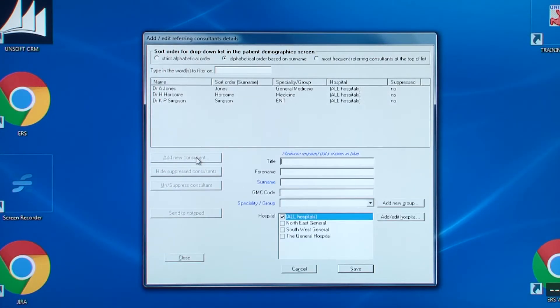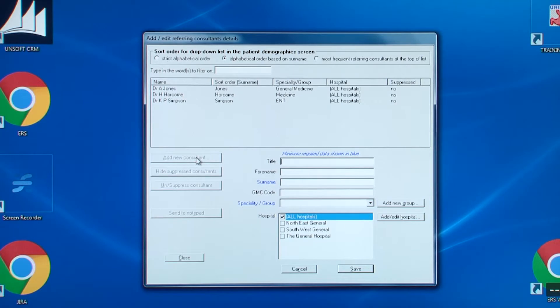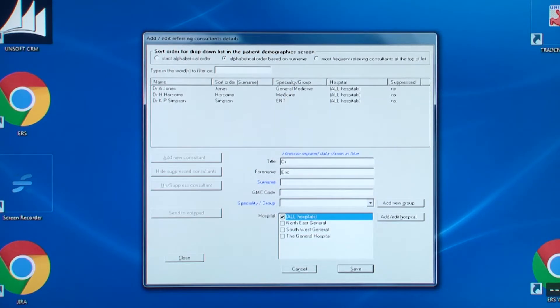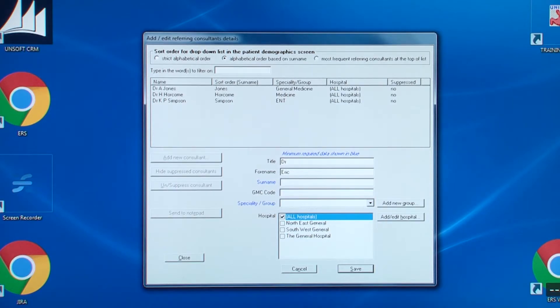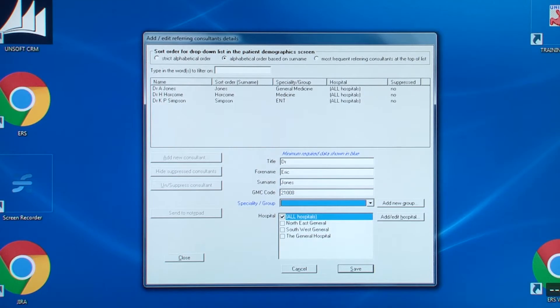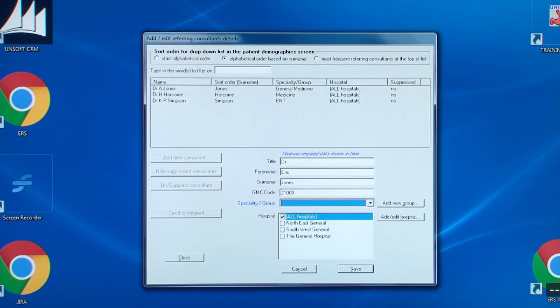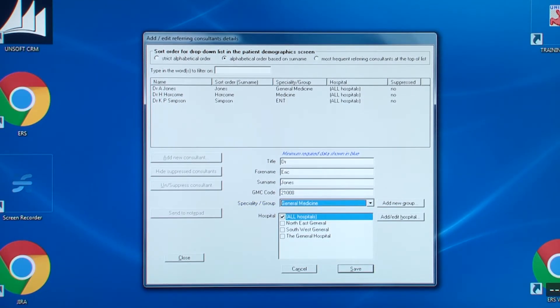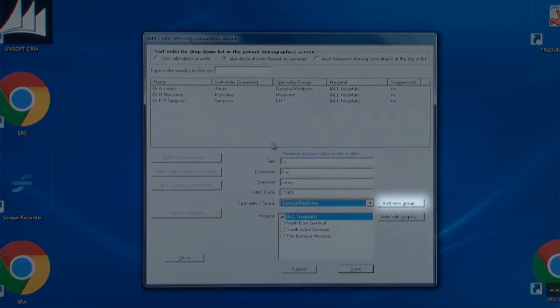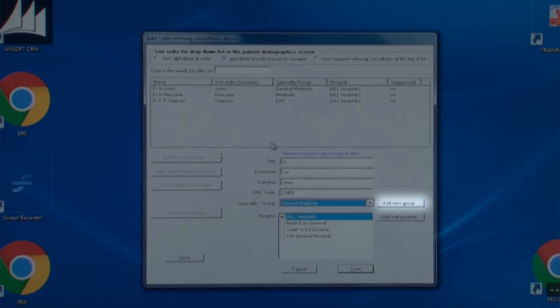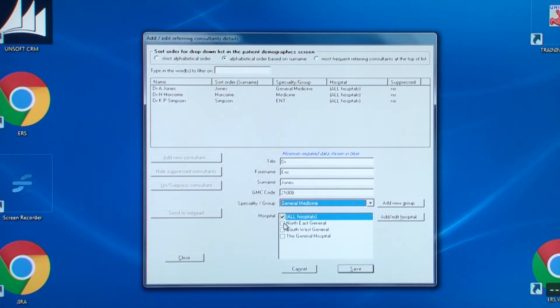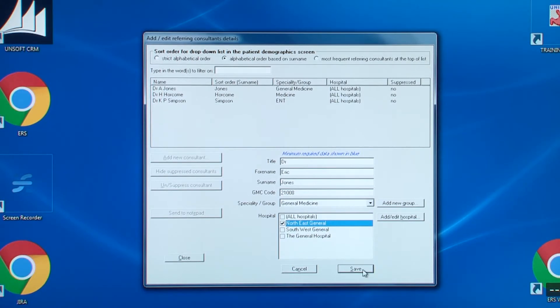You begin by entering their title. Next, you add their forename. Their surname is in blue as it is an obligatory field. Next, optionally, you enter their GMC number. And then there's specialty. And if it's not in the drop-down list, you can add it by clicking this button. Finally, you need to say which hospital they are based at. Now click save.